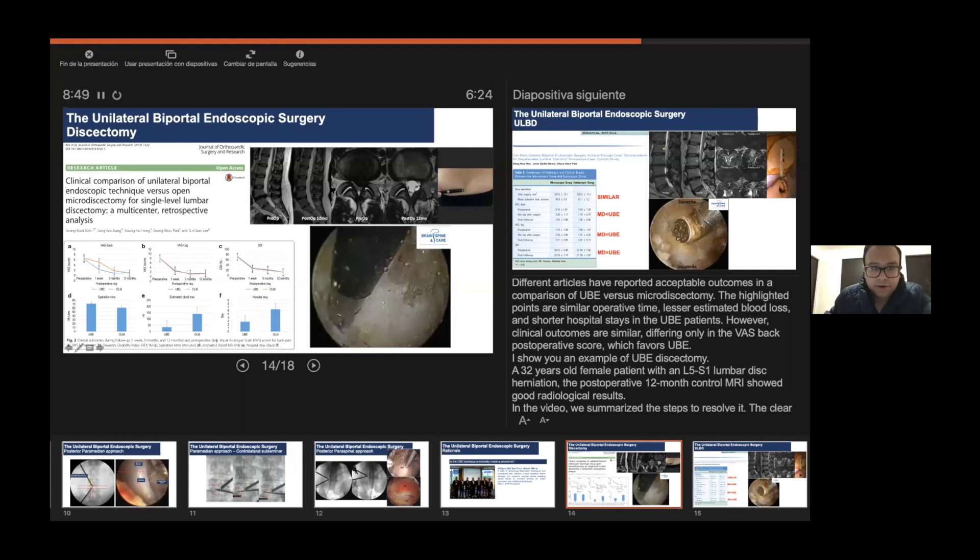However, clinical outcomes are similar, differing only in the VAS back postoperative score which favors UBE. I show you an example of a 32 year old female with a discectomy at L5-S1 lumbar segment. The postoperative MRI at 12 months shows good clinical results. Here in the video we summarize the steps to perform the discectomy. We perform a small laminotomy, then we detach the cranial insertion of the ligamentum flavum. Finally we have control of the subarticular zone where the disc herniation is, and then we perform the discectomy as usually performed in open or microsurgery.